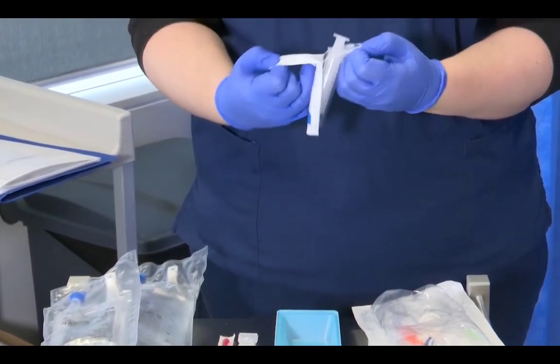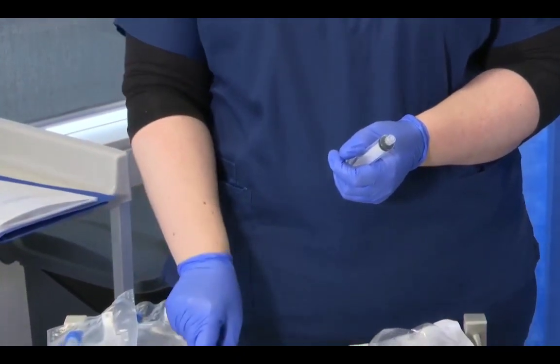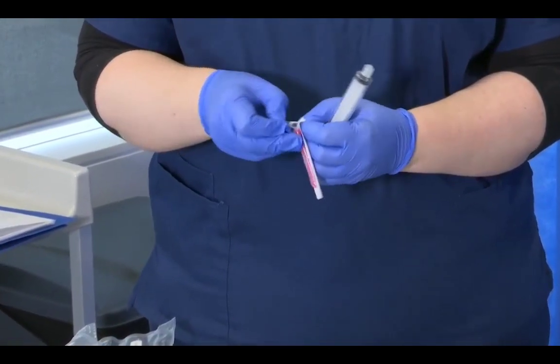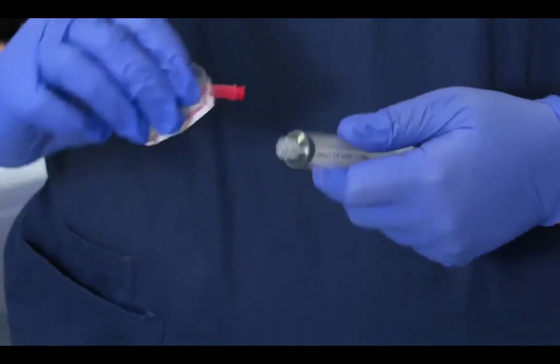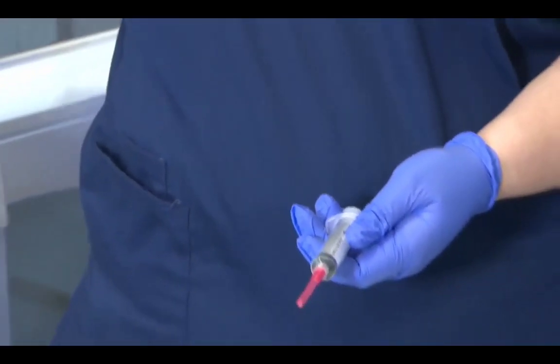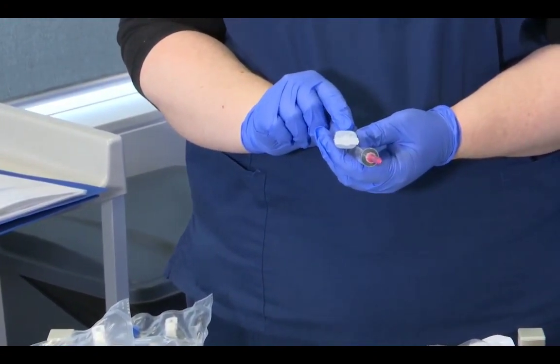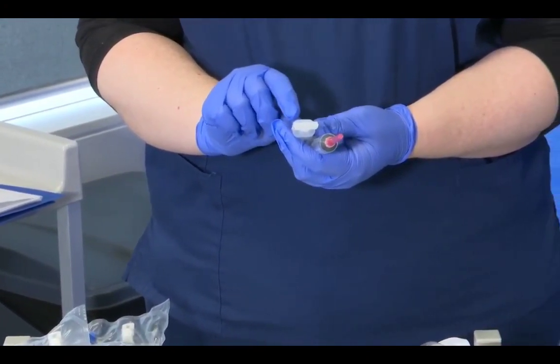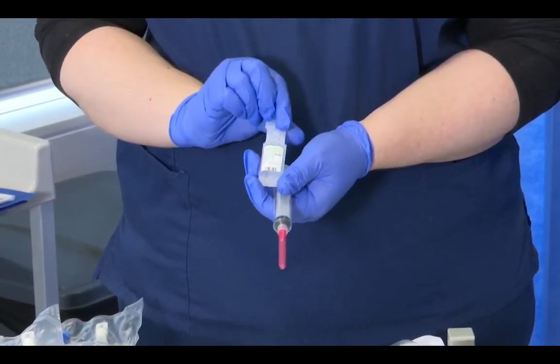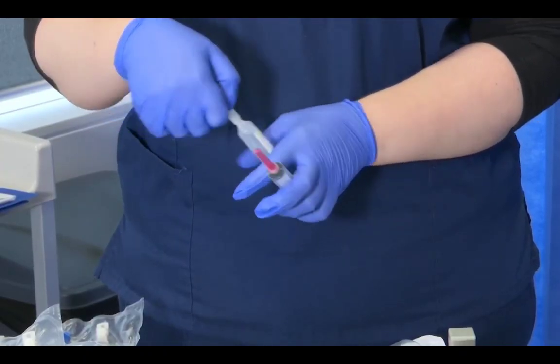So opening up our 10 ml syringe, opening up our red needle, screwing the red needle onto the 10 ml syringe, and at this stage we perform our second check because we're at the point of preparation. Sodium chloride 10 ml expires 2025, and this is sodium chloride to flush our cannula.